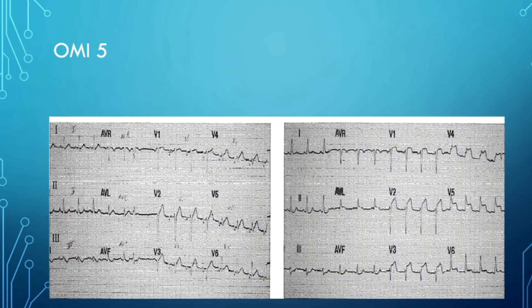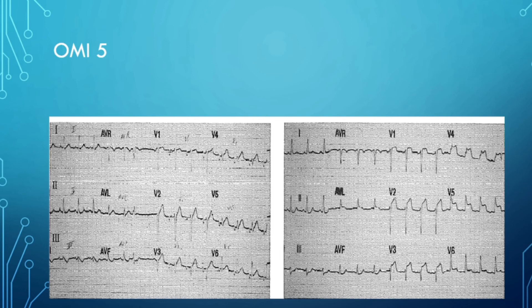This example shows why serial 12-leads are so important. The left one shows some hyper-acute T waves in V4 — just slightly larger than the QRS complex, and maybe a little in V3. Then a few minutes later: massive ST elevation in V2, V3, V4, V5, V6, and a little in V1, a lateral MI in lead 1 and AVL, and depression in leads 2, 3, and AVF. That is why it's important to do serial 12-leads — just wanted to hammer that point home.